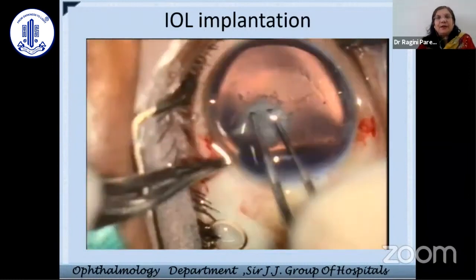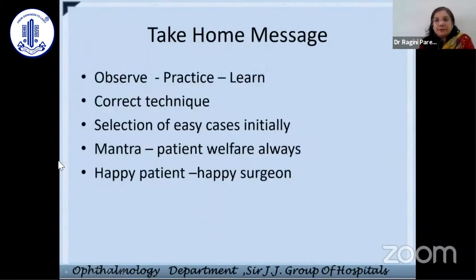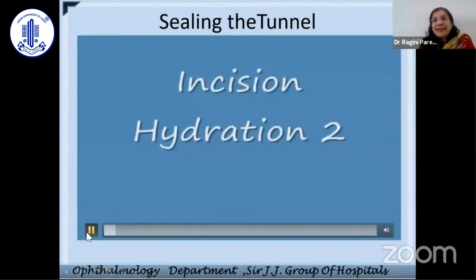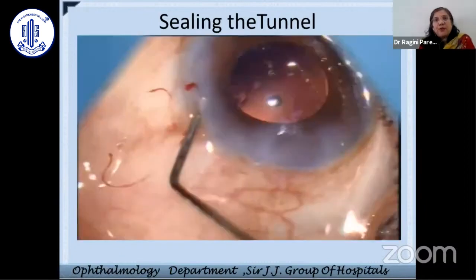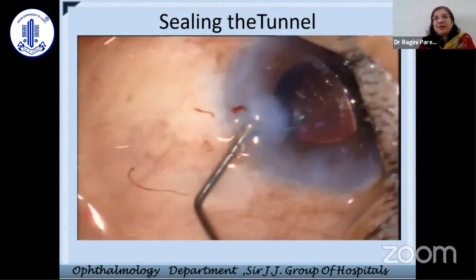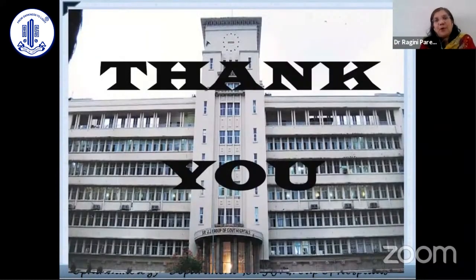It gently opens. There is one slide which is remaining, and I'll show you only one, which is very important to seal the tunnels. The closure of the wound is extremely important in any surgery. So sealing of the incisions are very, very important. One must observe and learn properly. A happy patient is equal to the happy surgeon. Maintaining the patient's welfare is extremely important.